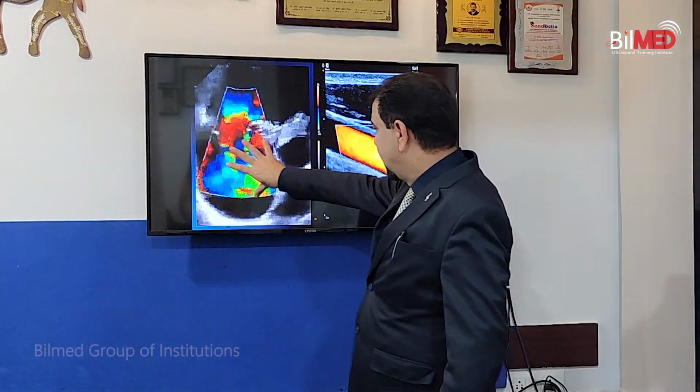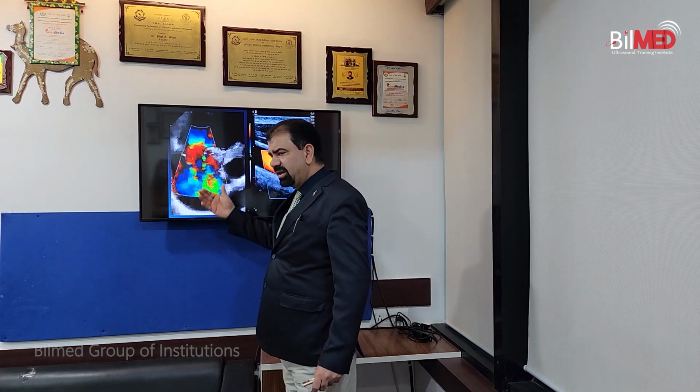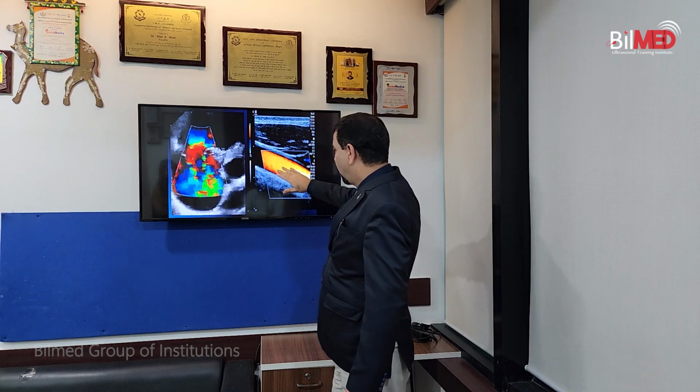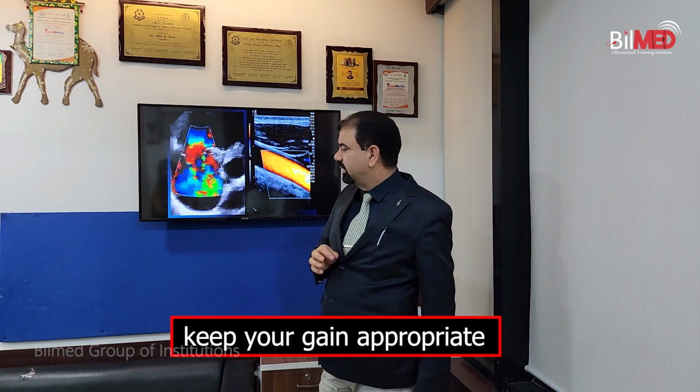Then appropriate gain. If you have overgained the image, you will see an overlap of the colors. So set an appropriate gain. The same gain knob will now behave like the color gain. Now you have to set it so that you are seeing the vessel only, not the overlap of the colors. So keep your gain appropriate.